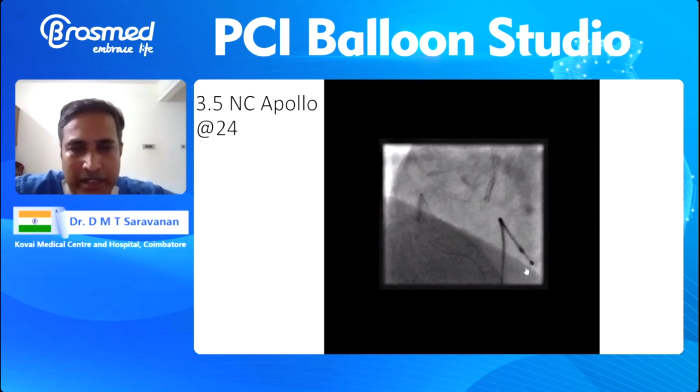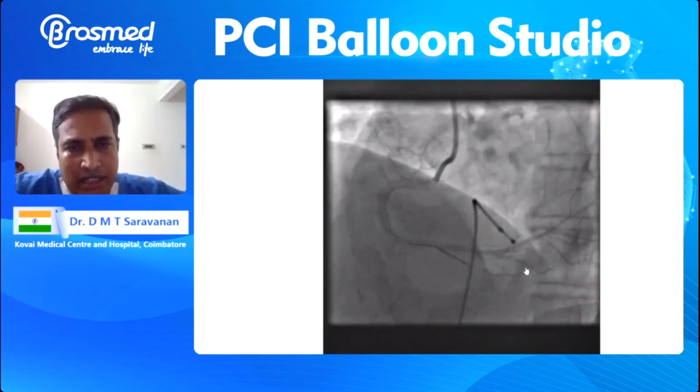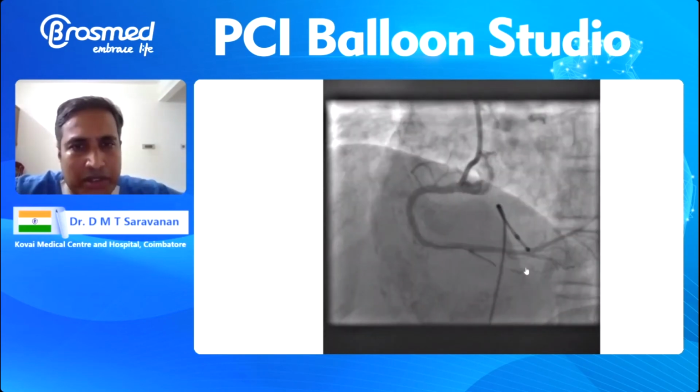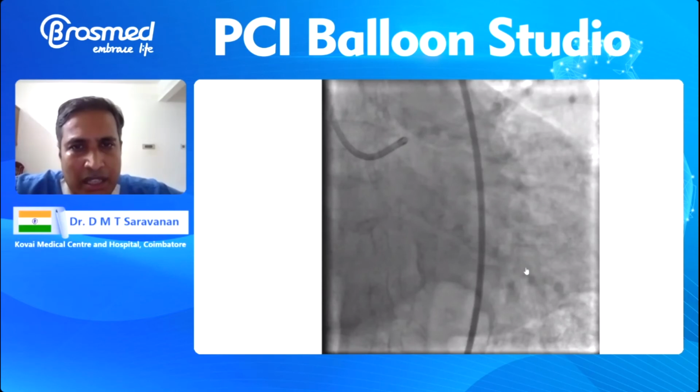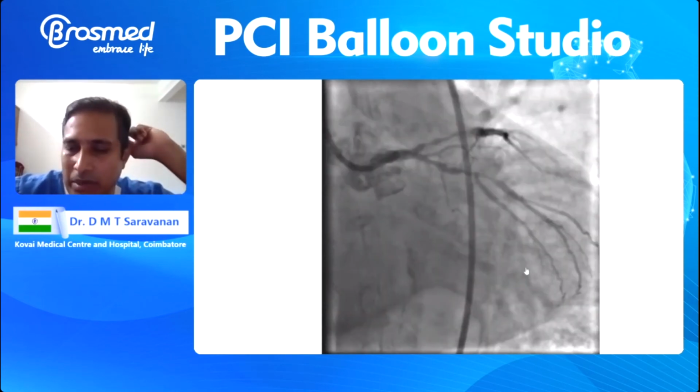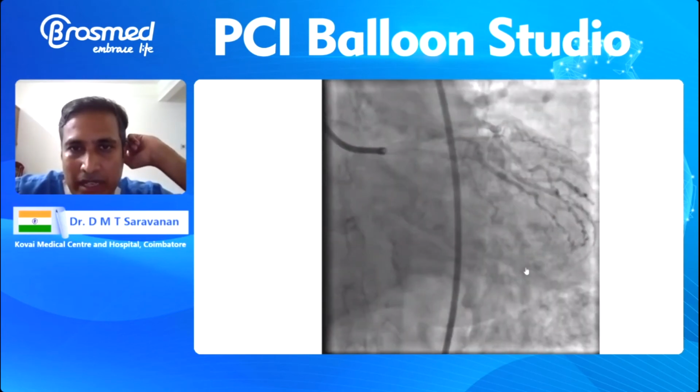But anyway, got it there. High pressure bump dilatation, and that's the end result. This was good, and then proceeded to the left. Initially I tried to do IVUS first to see whether we could go directly to IVL, but the IVUS could not go, so I went to the rotor for the LAD.